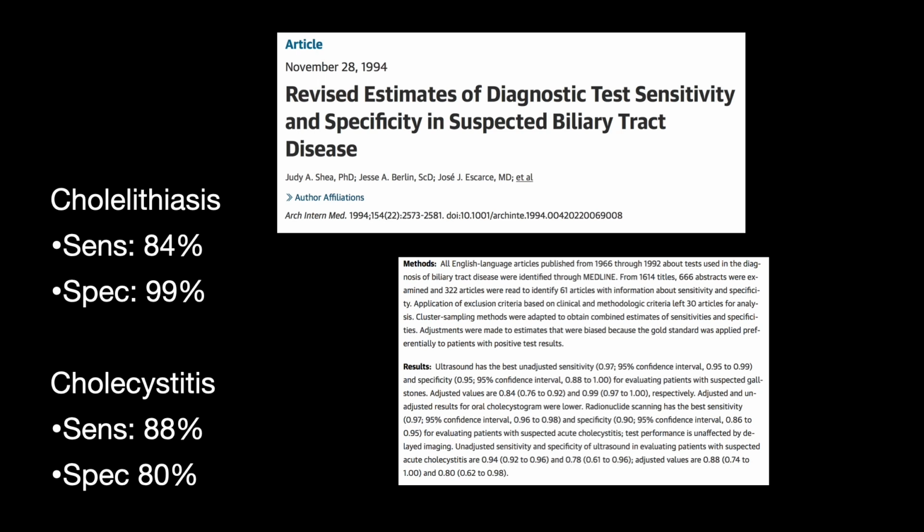It's got good test characteristics, but also it has some things that other modalities don't. I mean, first off, plain film x-rays just won't see it. The test characteristics aren't there, right? But ultrasound does not have ionizing radiation, right? It's sound energy. And so it's considered to be safe for children and safe for pregnant women, right? And so when you have particularly those cohorts, but generally everybody who you're concerned about biliary disease, going to ultrasound as your first choice is highly justifiable, especially in the early literature, but subsequent literature as well.